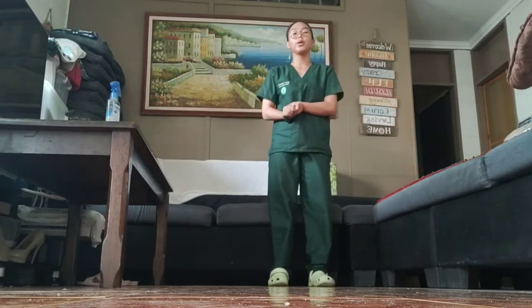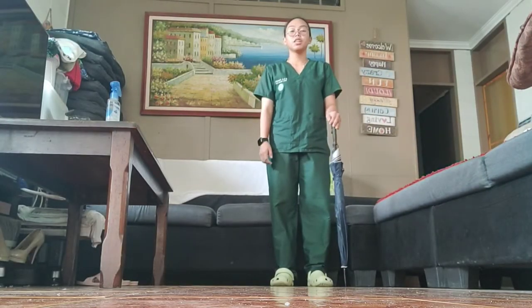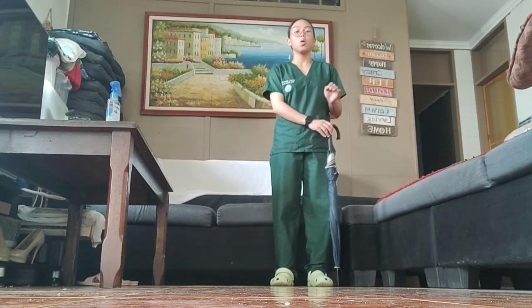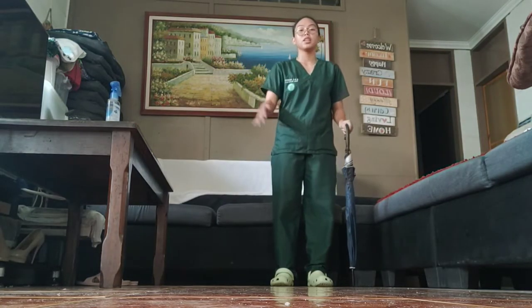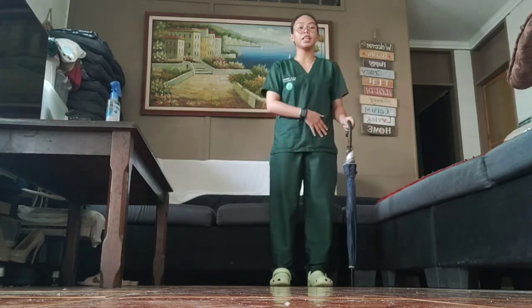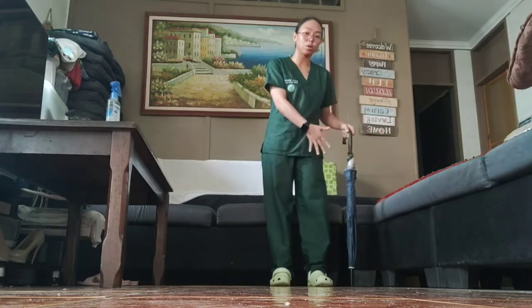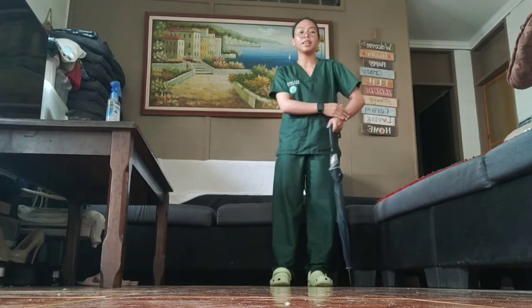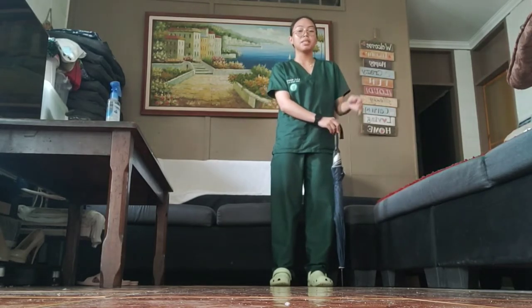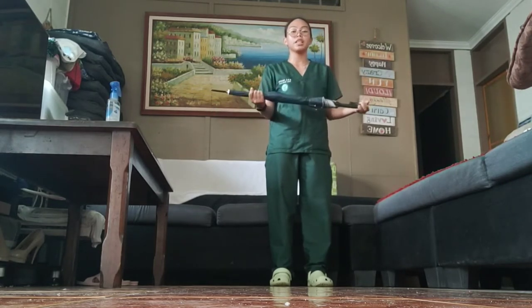The first assistive device we're going to use is the cane. We have here an improvised cane. We need to help the patient walk using the cane. Make sure the patient holds the top of the cane beside the stronger leg. For a proper fit, the foot of the patient must be at least 4 inches away from the bottom of the cane, the elbow bent at 15 to 30 degrees, and the wrist level with the top of the cane.